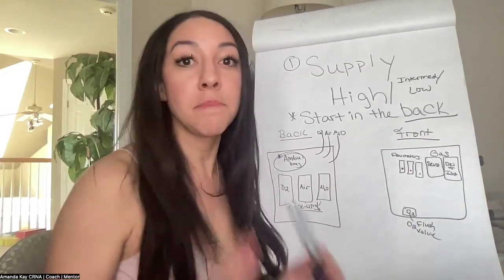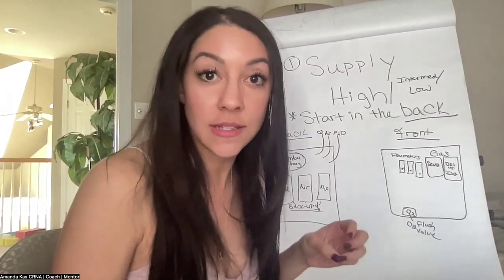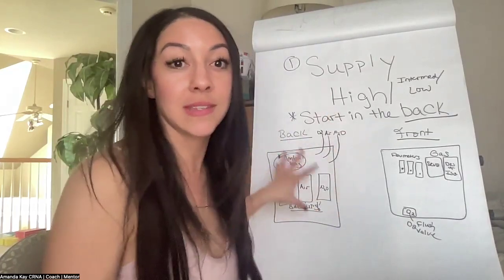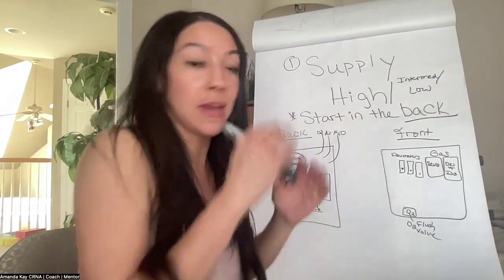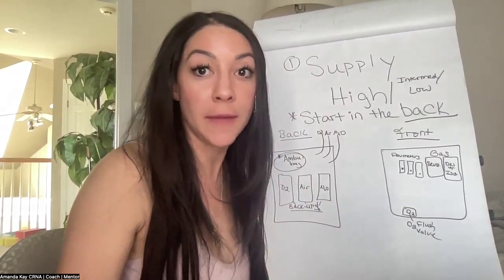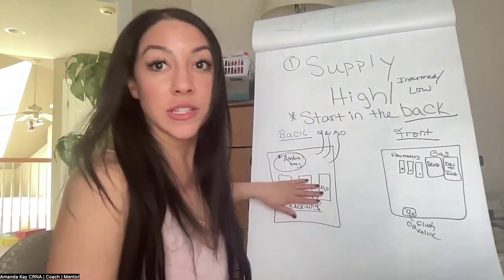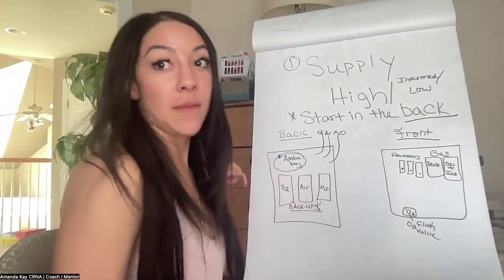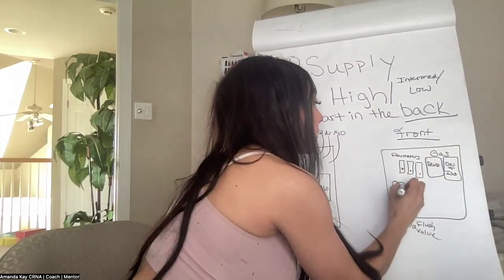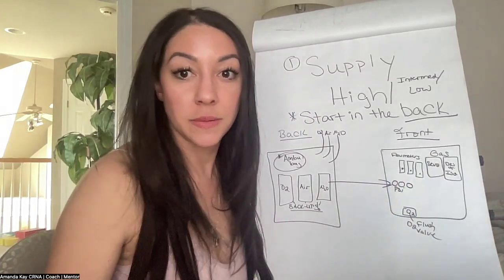The main job of this high pressure system is to prevent cylinder misconnections and prevent leaking of the cylinders into each other when the pipeline is being used. So this is why this is a high pressure system, because we want to make sure that these aren't leaking into each other and we're not having any misconnections. Your high pressure system is the cylinders to the regulators or the diaphragm valves that read the PSI in the front. That's your high pressure system.